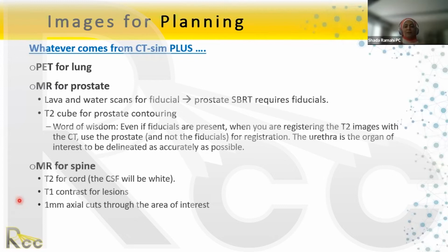Now, let's say that you do a scan first and the imaging department did not receive the instruction to just concentrate here. Usually they would give you a full scan, a full thoracic scan, a full lumbar scan, or a full cervical scan. And even if you go with the thoracic spine, the curvature changes. So when you're doing registration, concentrate on the region where you're doing the registration. Concentrate on the vertebra that you'll be treating.